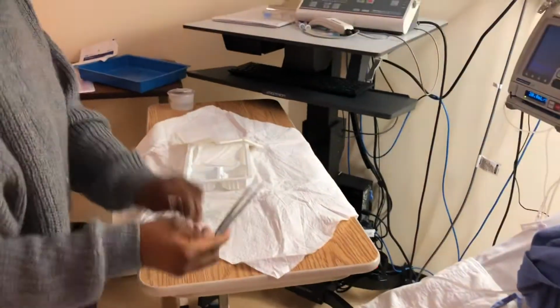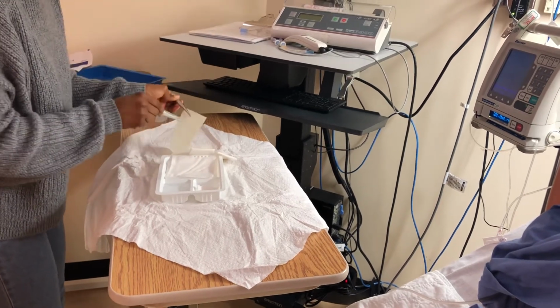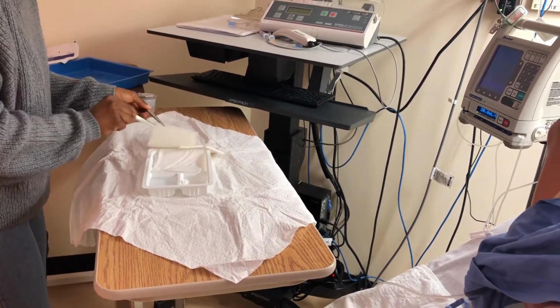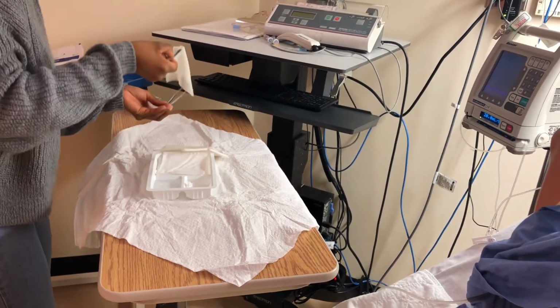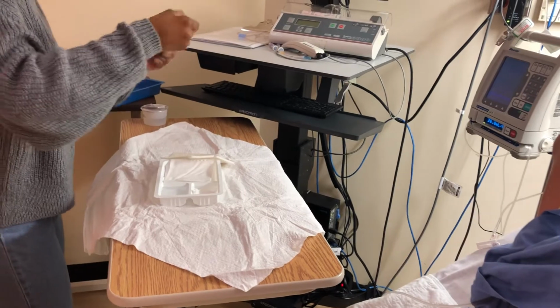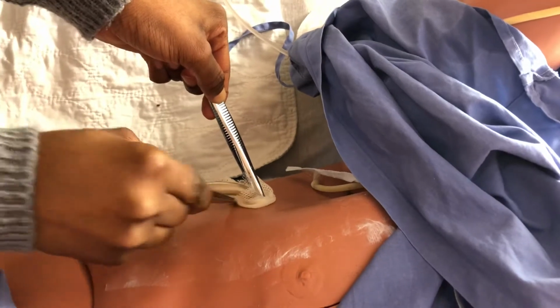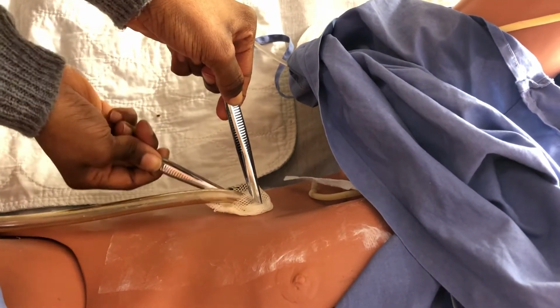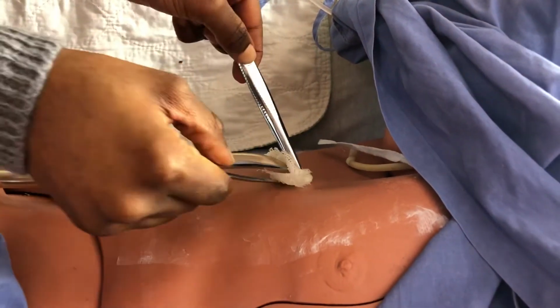So now I'm going to close with the jelly net. Dry it now. So I'm just gonna wring this out and then use this to occlude this completely. Make sure it is completely occlusive. Now we're gonna apply the gel net. So put the jelly net around it. Ensure it is fully occlusive.